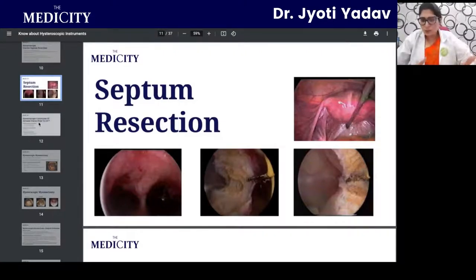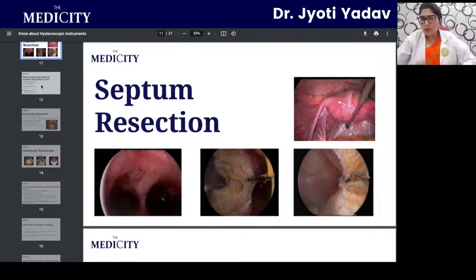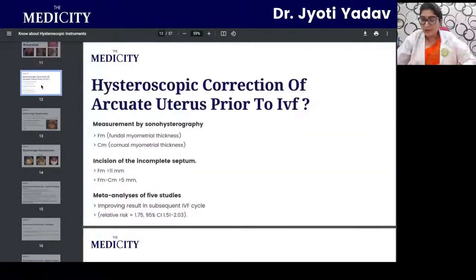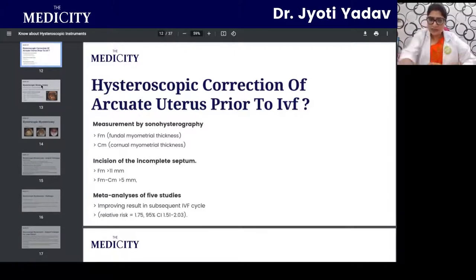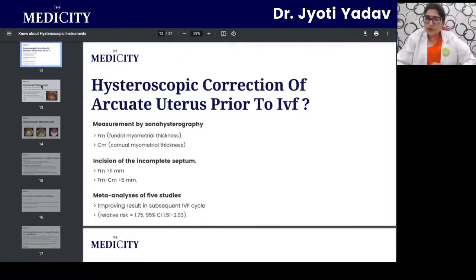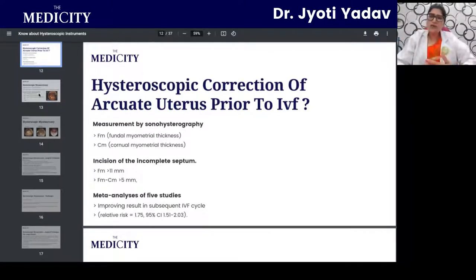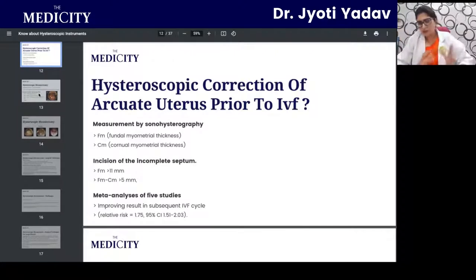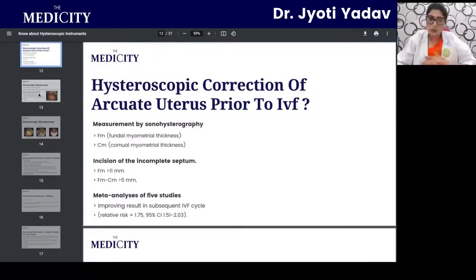Pictures of the uterine resection are shown as seen on the camera — images showing two different cavities before correction. Moving to another uterine malformation, the arcuate uterus: when taking an infertility patient for IVF, all uterine malformations must be corrected beforehand, and the arcuate uterus is another malformation correctable with hysteroscopy.